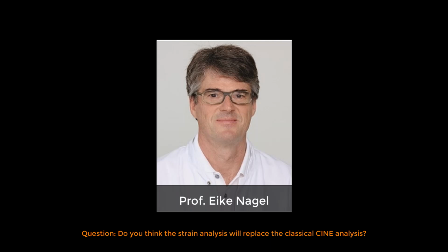So I think if we have an MR ejection fraction which reaches the same quality or maybe is a touch superior to echo, and we can save a significant amount of time during scanning, this could potentially be done based on 3 long-axis views and then just do the strain analysis. But this would need to be tested.